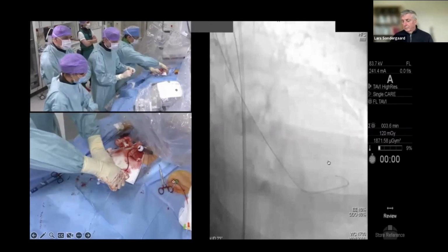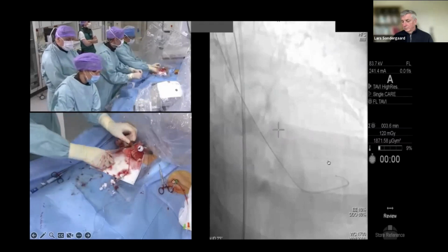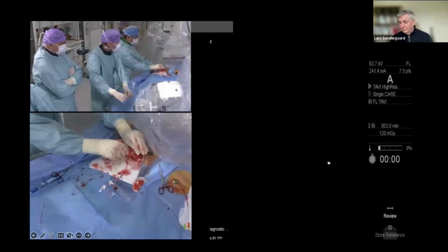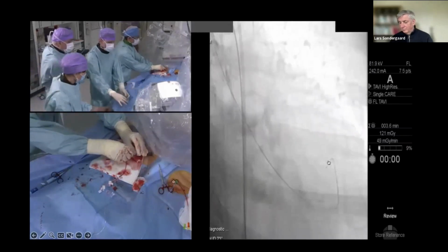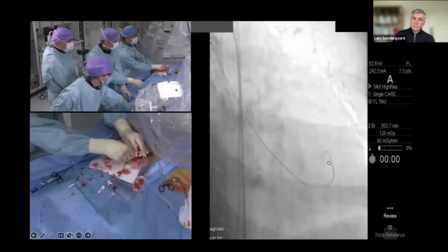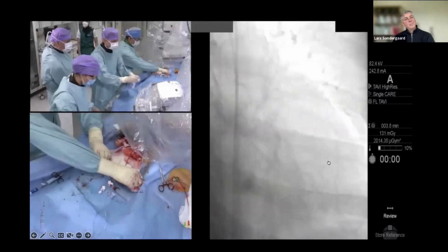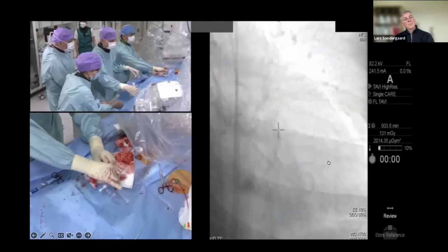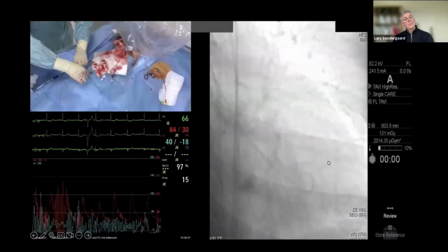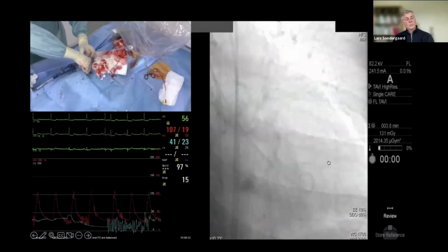Since this patient is treated under local anesthesia, we can only assess for paravalvular leak afterwards using aortic root injection and hemodynamic performance. We cannot do transesophageal echo. So hemodynamic assessment is going to be an important part of the assessment of PVL. What we're going to do now with the pigtail is, of course, measure the gradient. We know the patient has severe aortic stenosis, but maybe more important, we're going to record the diastolic pressure in the aorta and the end diastolic pressure in the LV, and then compare that to what we see afterwards.